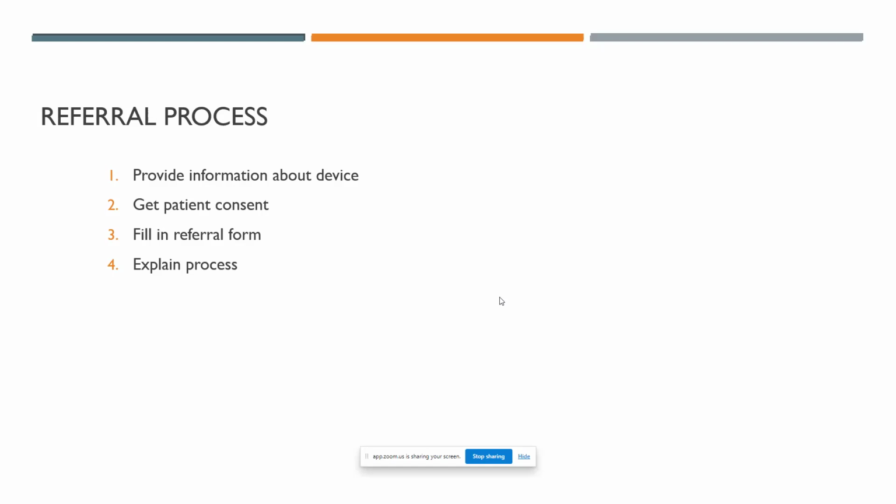And then you need to fill in the referral form. But before you even get to that, I think explain the potential process, which I'll get to in the next two slides. Just explain what process they are looking to go through should the referral be accepted and sent, and what they might be looking at. Because when a patient is dropping off a referral, there isn't always an audiologist who can sit down with them and speak to them. So we want to equip you as well to be able to have that conversation with them, just basic, so that they are at least aware of what they're getting themselves into. They know what they should be expecting, or they have an idea of what to expect along this journey.